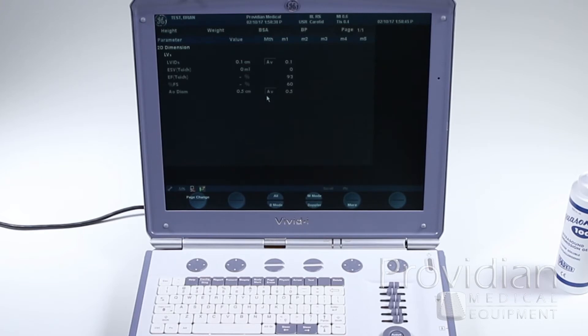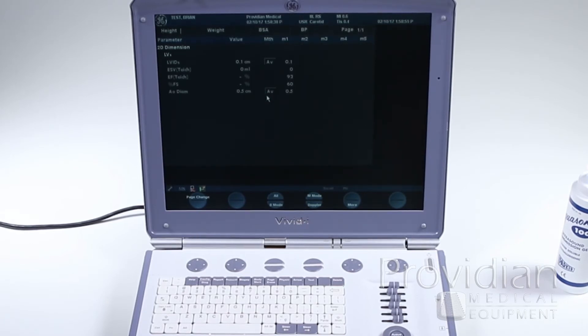This is the same on any other ultrasound machine. If you don't use a specific calc or have it assigned to a specific piece of anatomy or calculation, it won't show up in that report. That's just an FYI.